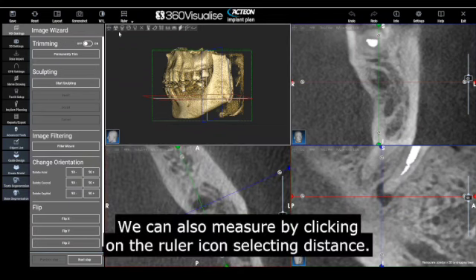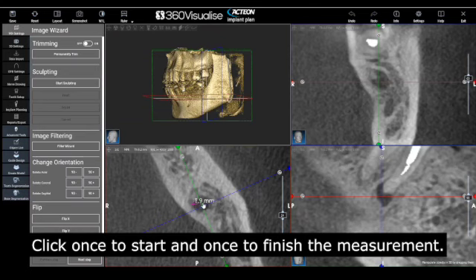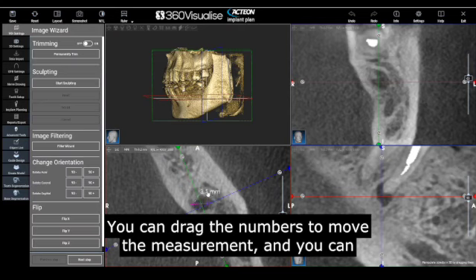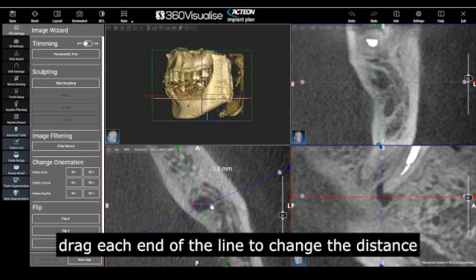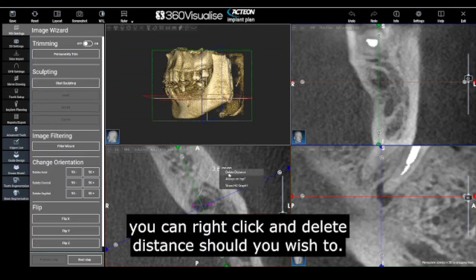We can also measure by clicking on the ruler icon and selecting distance. Click once to start and once to finish the measurement. You can drag the numbers to move the measurement, and drag each end of the line to change the distance. You can right click and delete the distance should you wish to.